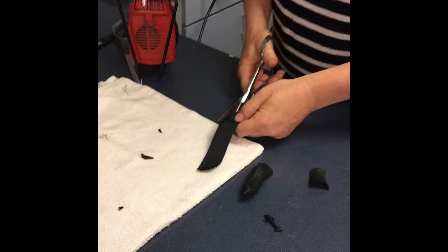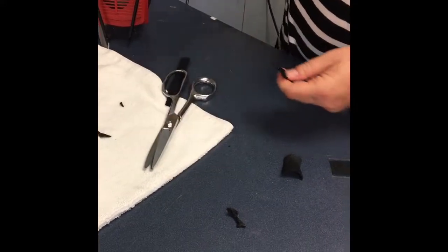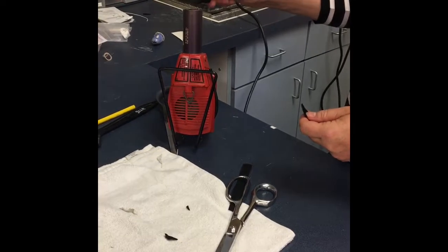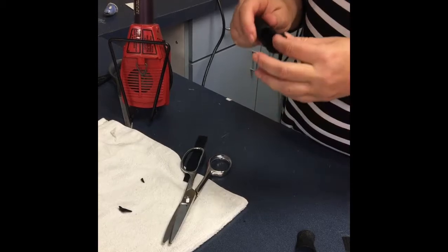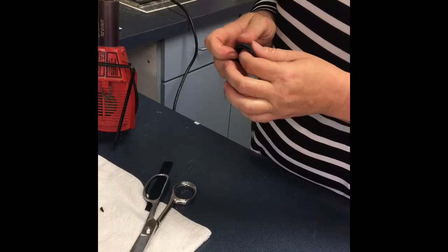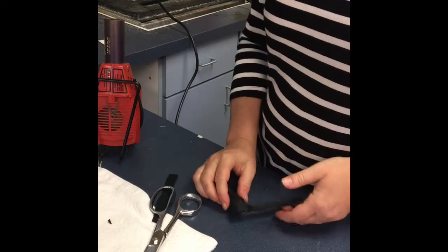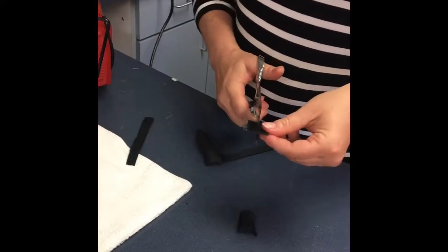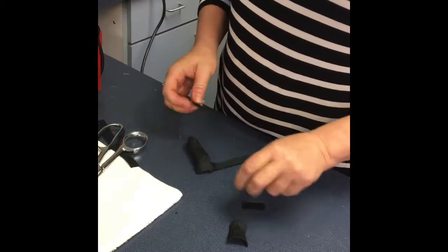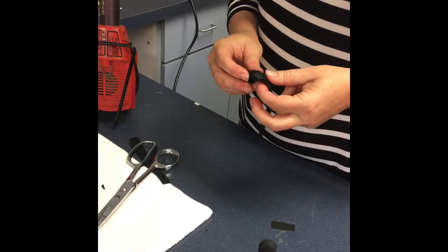We can secure a small strap of about a half an inch by briefly heating the material, adhering the strap right to the material. Then I'm going to cut a corresponding piece of hook velcro to be applied right over the loop velcro.